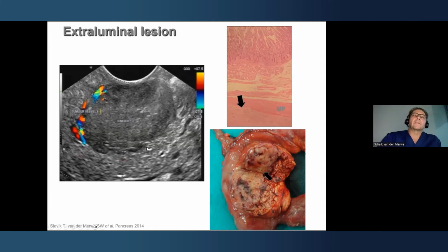So I think the first tier, the first layer of investigation should be for the junior person to recognize this. However, if you look carefully, the more experienced endoscopists will see that there's no pancreas tissue appearing between the transducer and this lesion. So that may suggest this lesion is originating from the duodenal wall rather than from the pancreas itself.